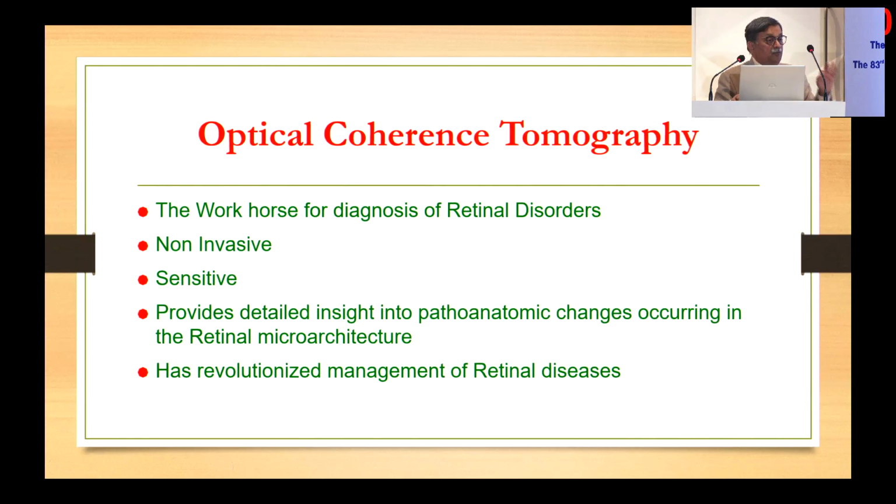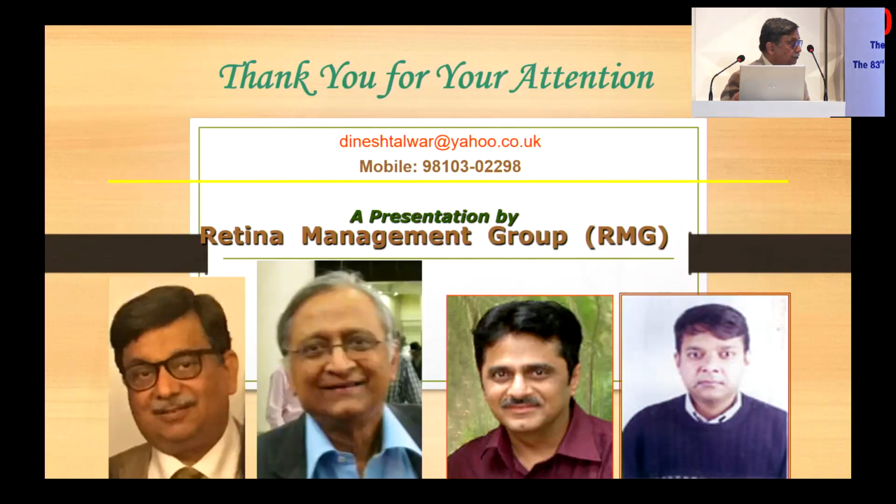So ladies and gentlemen, you can see there are lots of things to be discussed. You can ask whatever questions you want, but it's quite obvious to you that this is a workhorse for us for managing, diagnosing retinal disorders. It's non-invasive, it's sensitive, provides a detailed insight into the pathoanatomic changes, and has revolutionized the management of retinal diseases. Thank you very much.